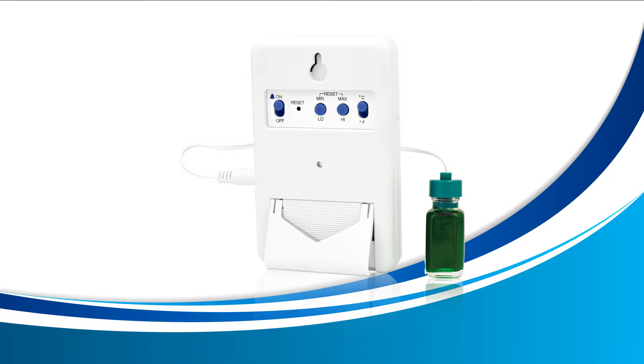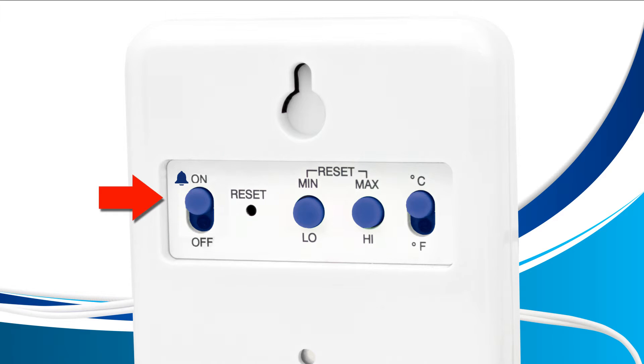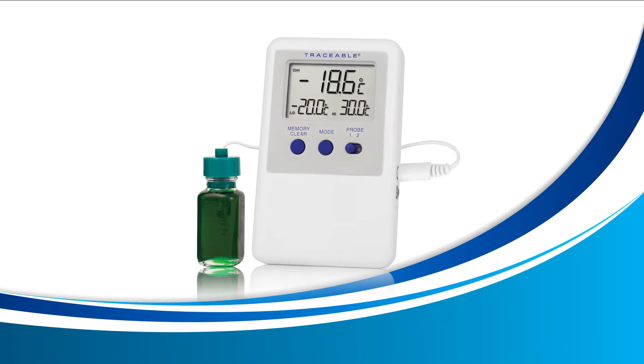Before we get started, we recommend that you disable your alarms so that it doesn't ring while you're trying to set your high and low alarms. To do this, look at the back of your device and locate the switch to the very left with the small bell next to it. Slide this switch down to off and we'll enable it again after we're done. Now turn your device around and let's get started.